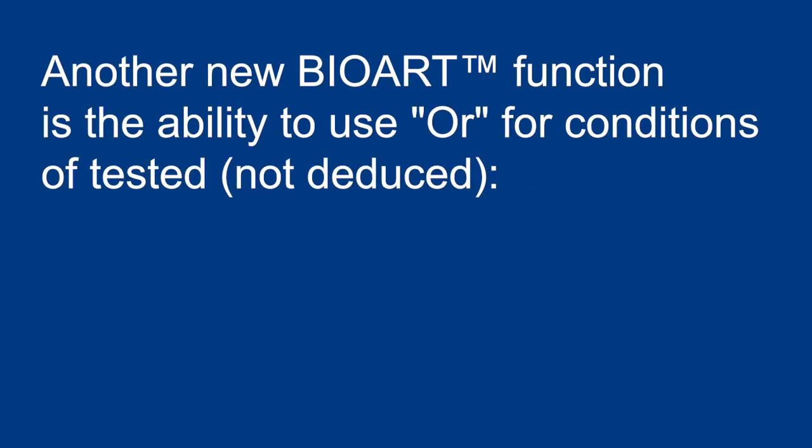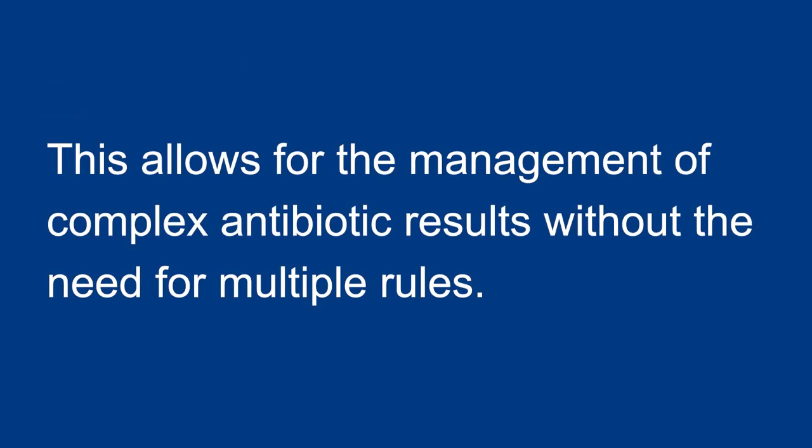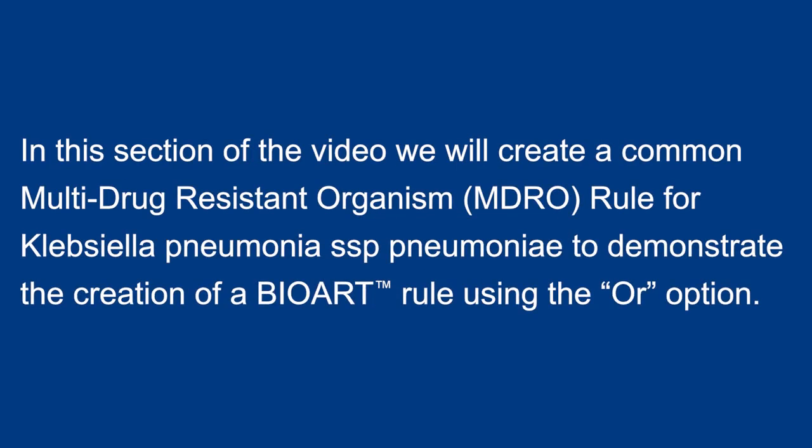Another new Bioart function is the ability to use OR for conditions of tested, not deduced, antibiotic MICs, or antibiotic interpretations. This allows for the management of complex antibiotic results without the need for multiple rules. Rules created using OR conditions may be used with any action, including the use of alternate organism label. In this section of the video, we will create a common multi-drug resistant organism rule, MDRO, for Klebsiella pneumoniae subspecies pneumoniae to demonstrate the creation of a Bioart rule using the OR option.